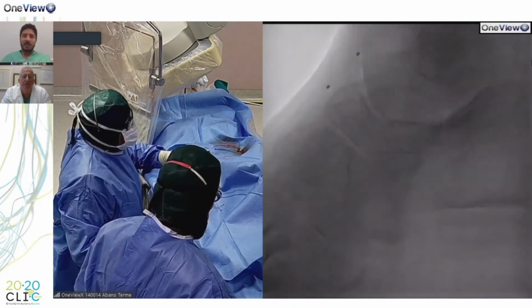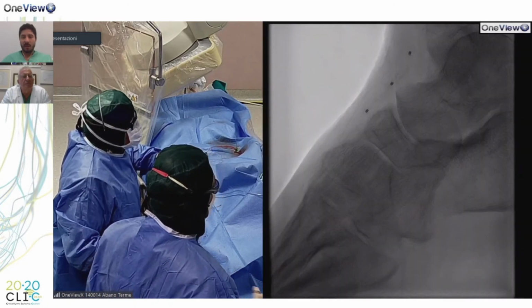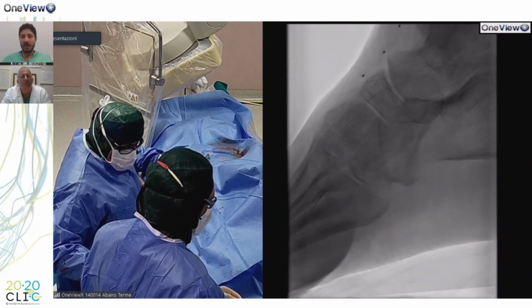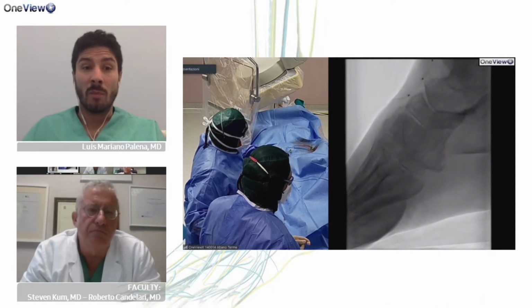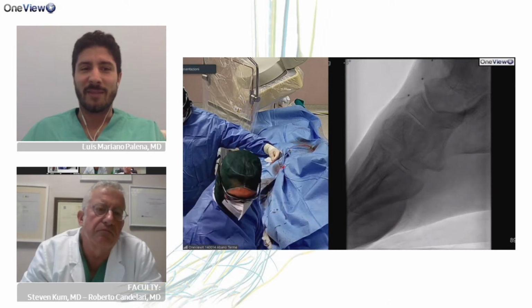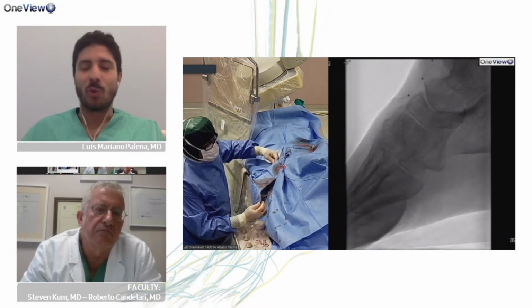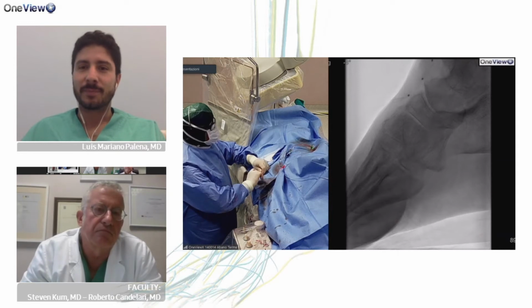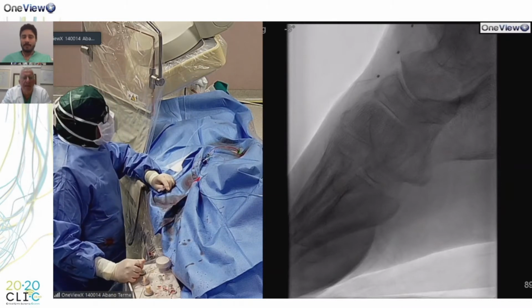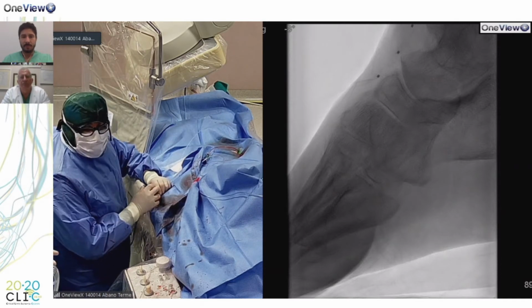I asked the question just to clarify to the audience and to all our friends, but honestly speaking, I agree with you. In most of the cases, we are able to arrive in the foot with an 018. And personally, nowadays, I use 018 guide wires more frequently than before, because the only 014 guide wire that I have available in my cath lab today is the Choice PT. So that's the reason why I use so many 018 guide wires. Okay, now we inject 1 ml of contrast medium just to check the outflow in the forefoot. Can I go with the contrast? Okay.